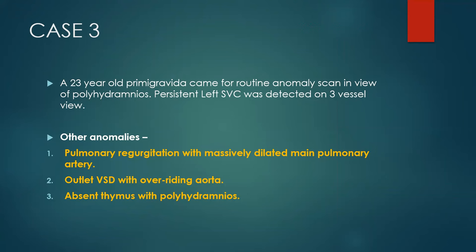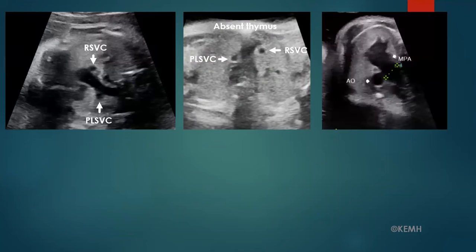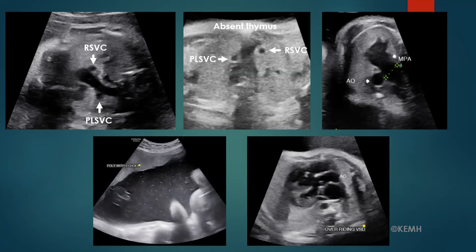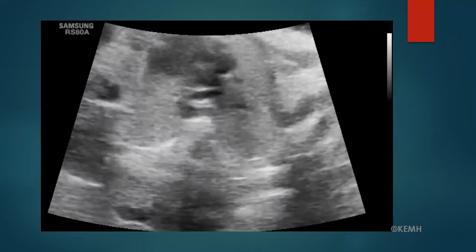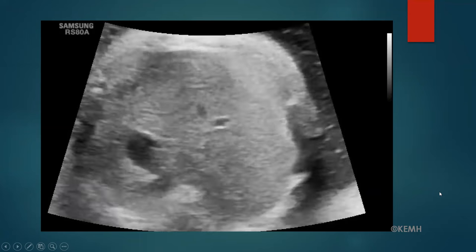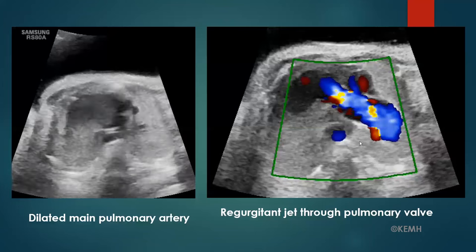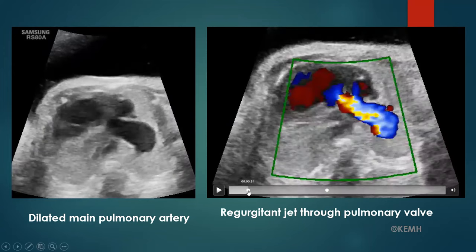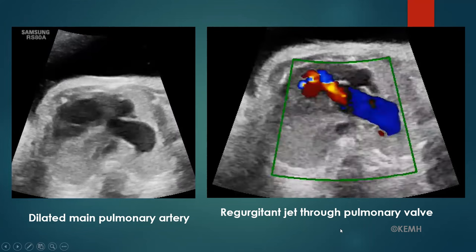Case 3 is a 23-year-old primigravida who was referred for polyhydramnios. The fetal heart showed PLSVC, absent thymus with aortic arch flushed to the sternum, a large main pulmonary artery compared to the aorta, polyhydramnios with echogenic bowel, and a ventricular septal defect with an overriding aorta. There was also a muscular VSD with a dilated main pulmonary artery and a large main pulmonary artery arising from the dilated right ventricle. Color Doppler showed a forward jet into the main pulmonary artery with a regurgitant jet as well. A diagnosis of absent pulmonary valve syndrome, a variant of Fallot's tetralogy, was made.